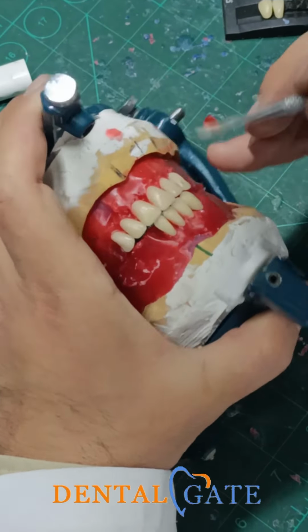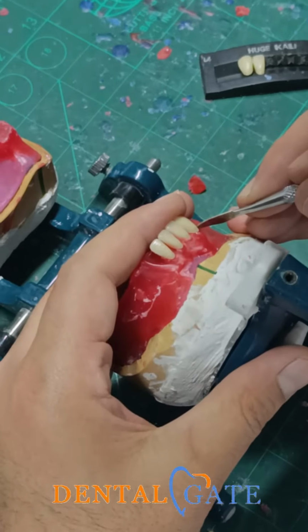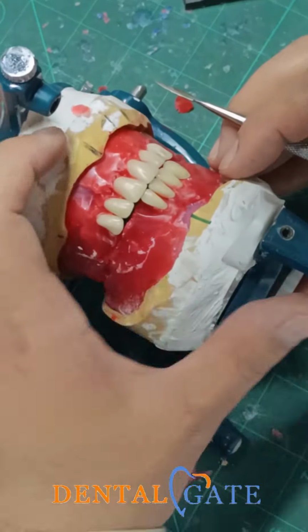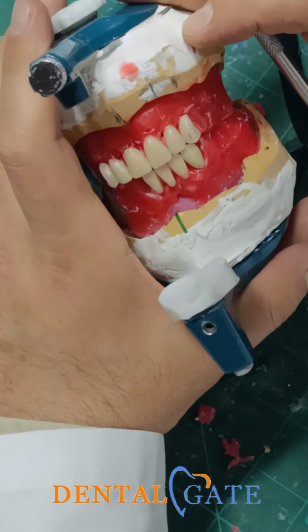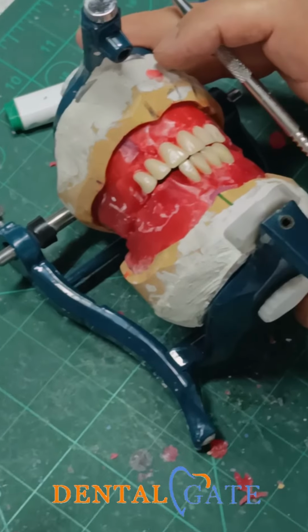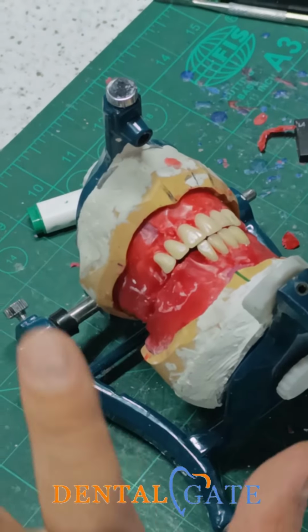Now I can say the canine is in normal position, but I think we need to make a contact area to remove this space here. So we shouldn't have any overjet and overbite? Yes, we make an overjet and overbite. Why? Because the overjet and overbite should extend to the canine, yes, for all anterior teeth. Okay? With the same 1 millimeter.